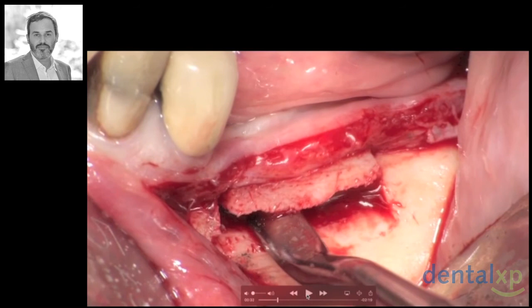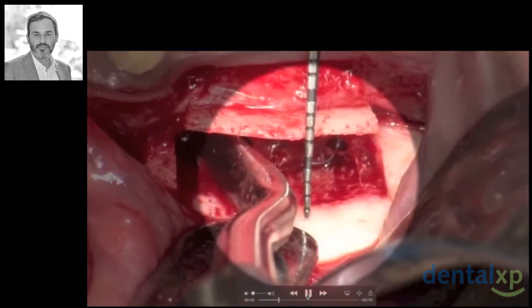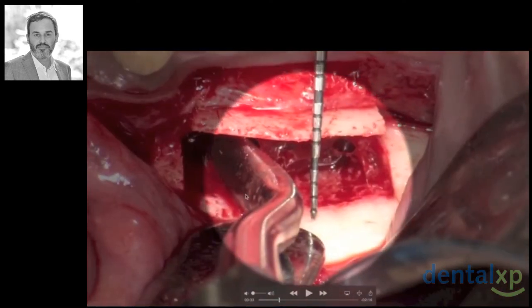After the osteotomies, we can see if we can shift the osteotomized segment coronally. And like this, when you raise the segment, this is the new situation, this is the new space, and in this case, I raised the coronal segment maybe 5-6 millimeters.